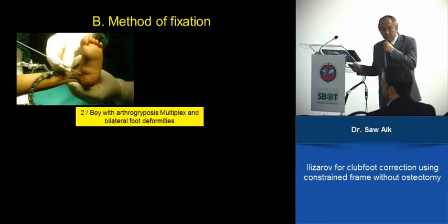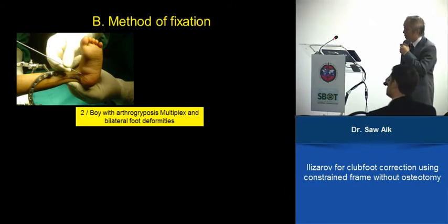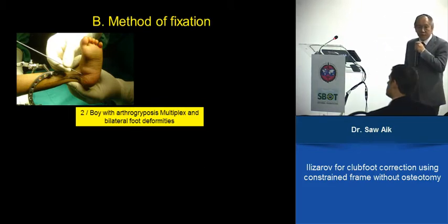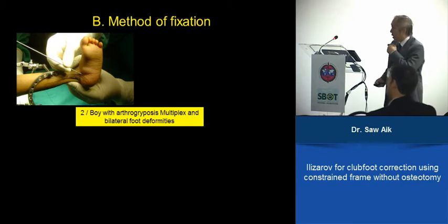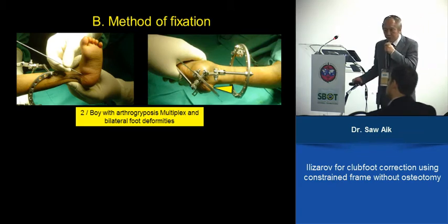Now that we have this construct, how do we fix it onto the bone? The first wire we usually insert by finger — we want to make sure that we fix the calcaneum. You push it in using your finger, then fix it onto the half ring or five-eighths ring. For the second one, you can use your power drill.